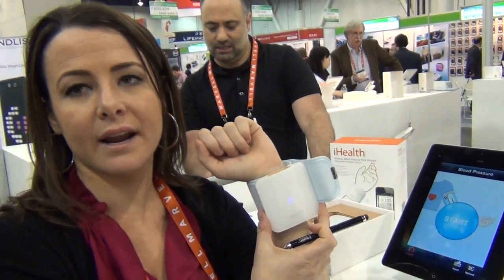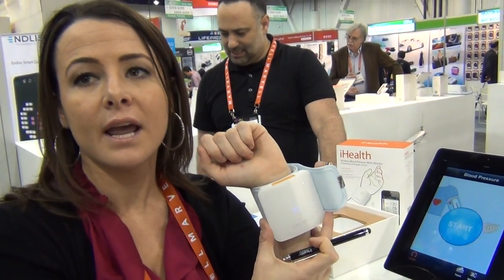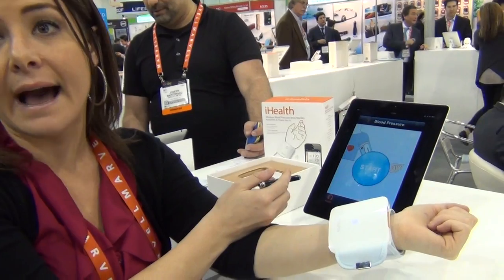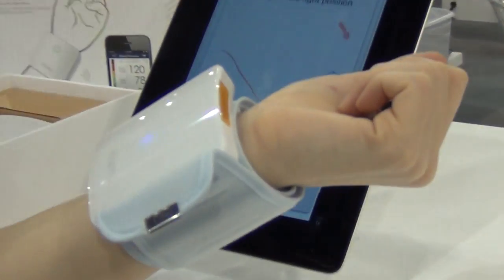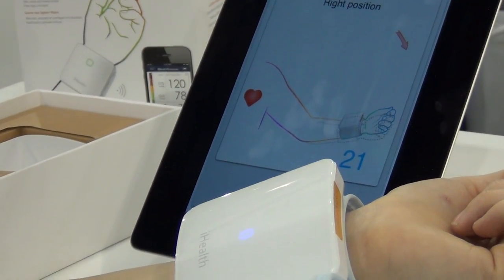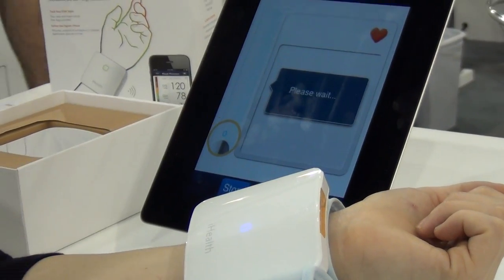So right here I have on the iHealth wireless blood pressure wrist monitor, and what I'm going to do is show you a demo of taking my blood pressure directly from my wrist through the iHealth My Vitals app. I'm going to hit the start button, and before I take the measurement, I have to make sure that my arm is in the right position before I can start the test. This will help ensure accurate results on my test.